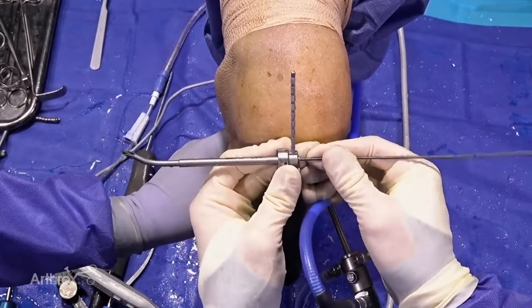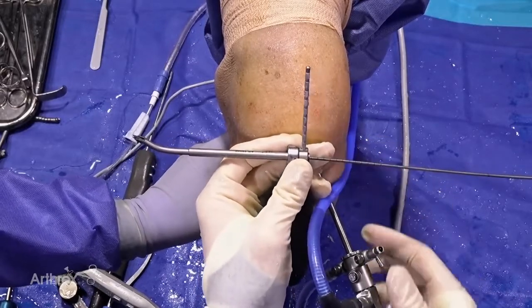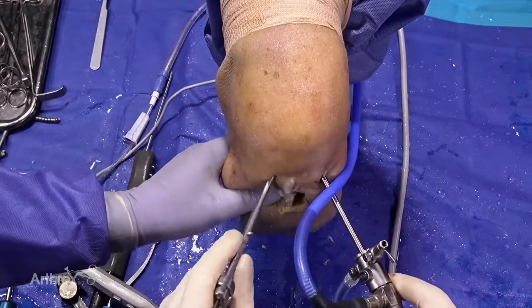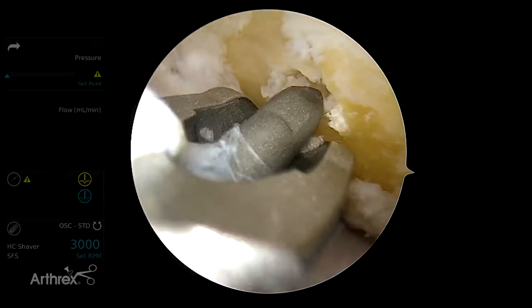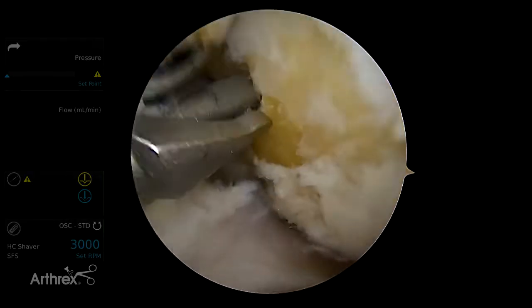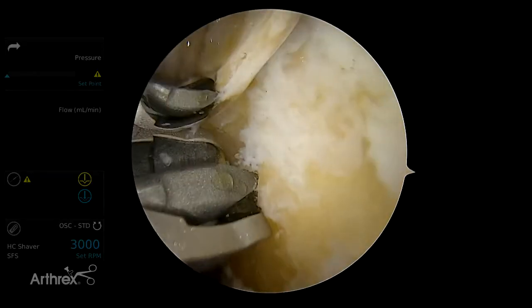One way to facilitate this procedure and make it smoother and faster is to have the wire pre-loaded in the guide with the tip just barely sticking out, so you're already loaded and ready to go. Once that's done it can be introduced very easily through the anteromedial portal and the whole construct is loaded and ready to drill, with the wire pre-positioned and held in the appropriate spot so it doesn't skive.